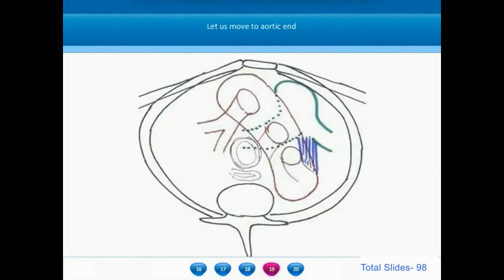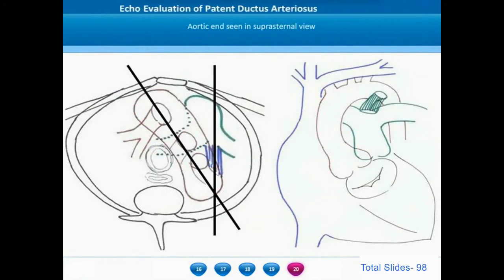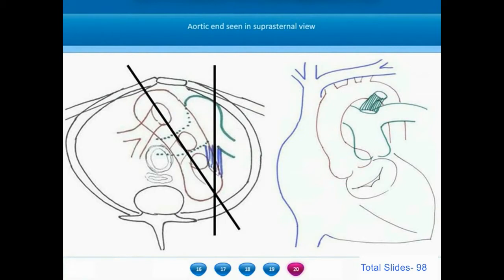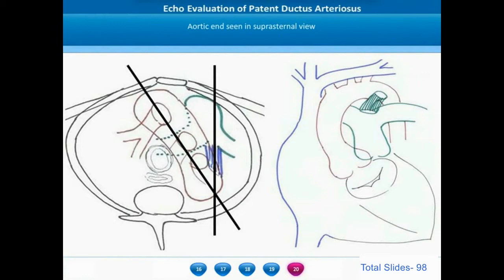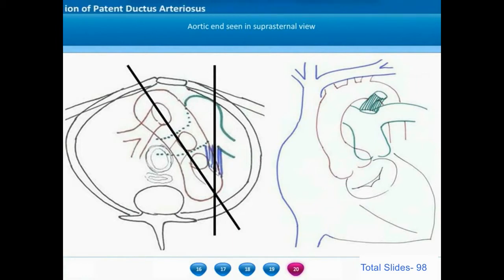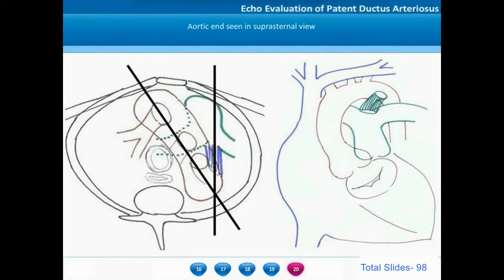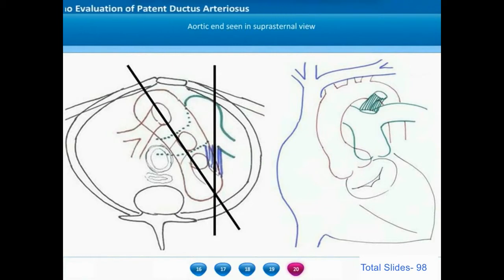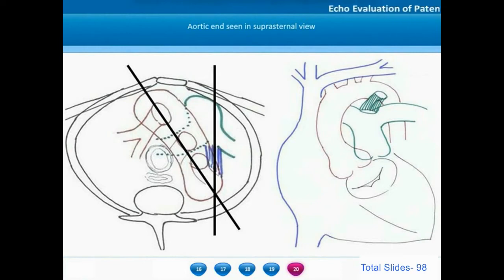We now move on to analyzing the aortic end of the ductus arteriosus, which is seen from the suprasternal view. To visualize the entire aortic arch from ascending to descending aorta, the probe is kept in an oblique plane. However, the duct arises from the anterior wall of the descending thoracic aorta and courses directly anteriorly in the sagittal plane, so the same view displaying the full aortic arch will not display the entire ductus arteriosus. We need to shift the probe to a more sagittal plane to get the ductus.